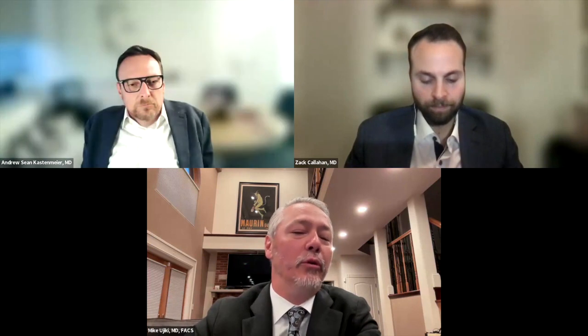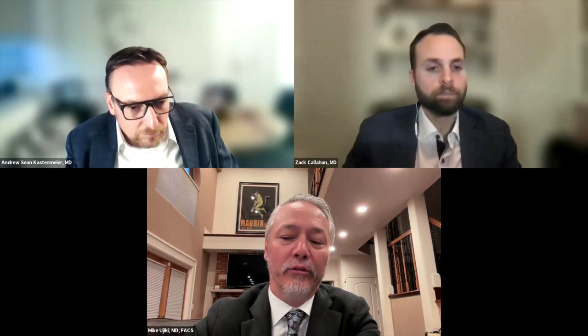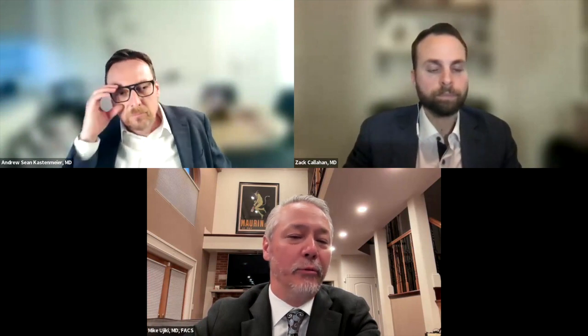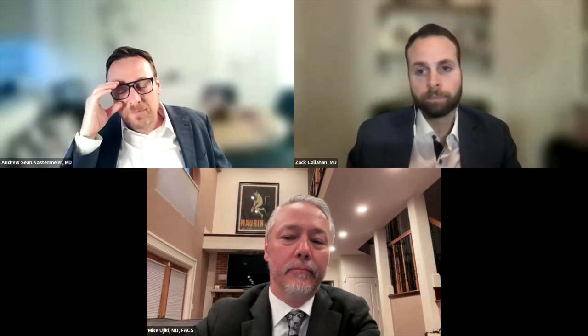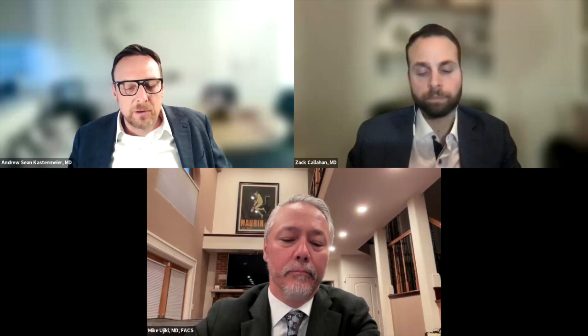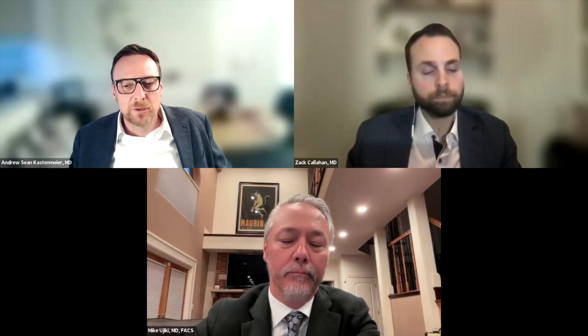And then Andrew, could you just reiterate, there's a question again about what you would do if the DI was still low post myotomy in POEM. I thought you had a great answer on that. Can you just reiterate your answer one more time? Yeah. So I go back into the tunnel, and when I've made my initial myotomy, like I said, I usually go about 1.5 or 2 centimeters beyond what I think the GE junction is, just based on my subjective measurements. And then I try to just divide the circular muscle fibers.